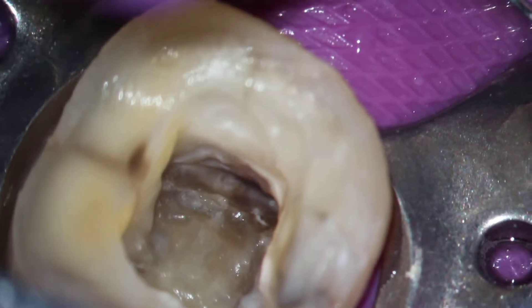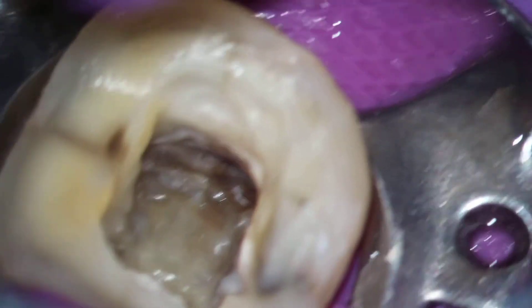As we increase magnification and increase power, you'll be able to see some additional organic debris that's down inside that canal system.